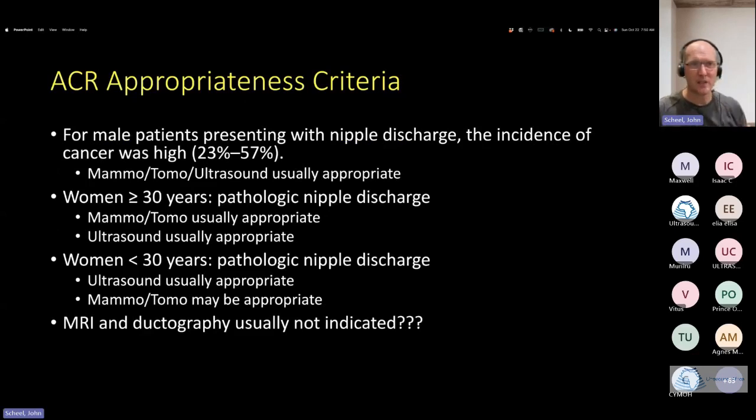According to the appropriateness criteria that we use, we typically start with mammography because calcifications can be helpful, and mammography shows calcifications more. However, if you do not have mammography available, then starting with ultrasound is appropriate, because we typically do ultrasound regardless of what the mammogram shows.